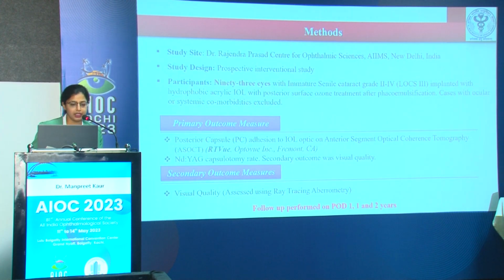rate and visual quality. It was a prospective interventional study conducted at Dr. Rajendra Prasad Center for Ophthalmic Sciences, AIIMS, New Delhi. 93 eyes with immature senile cataract grade 2 to 4 were implanted with hydrophobic acrylic IOL with posterior surface ozone treatment after phacoemulsification. Cases with ocular or systemic comorbidities were excluded. The primary outcome measure was posterior capsule adhesion to the IOL optic as assessed using anterior segment optical coherence tomography and the Nd:YAG capsulotomy rate.